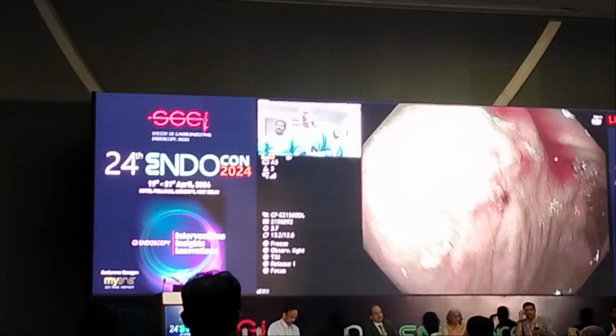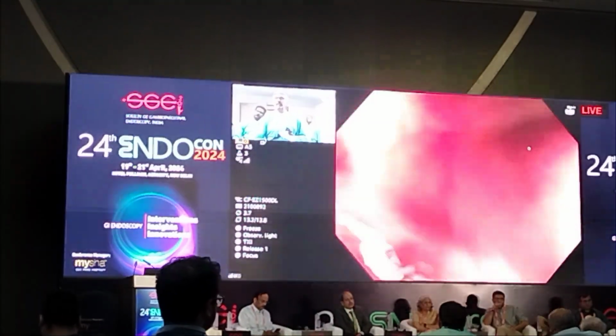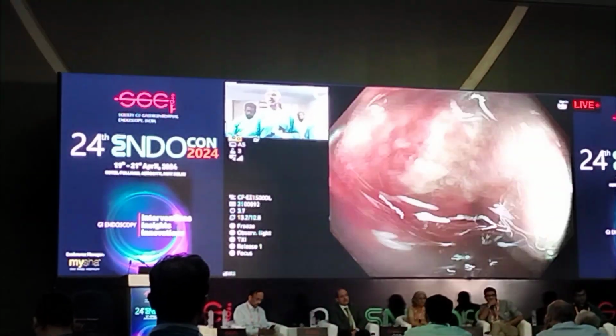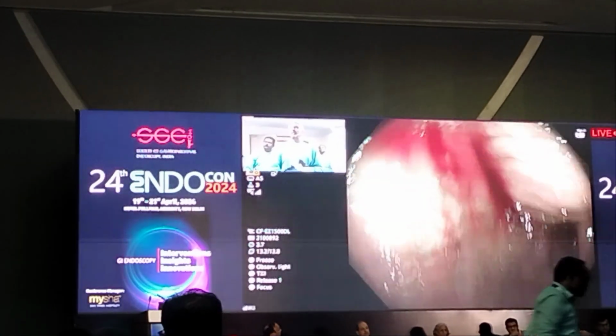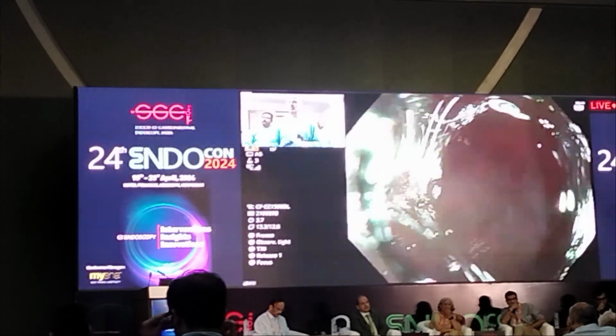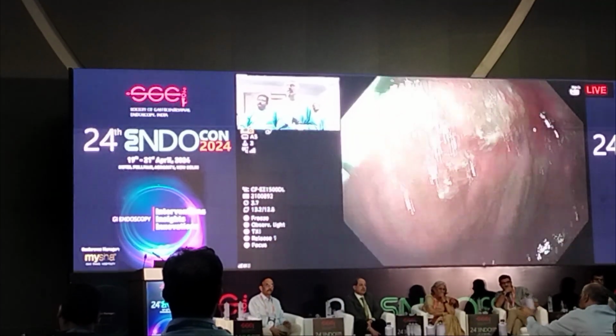I use NBI alone because I think there's no studies showing equivalency yet, but there are non-inferiority studies coming out. So I think if you don't have the ability to do chromoendoscopy, which still remains the gold standard, then virtual chromo is a good alternative.